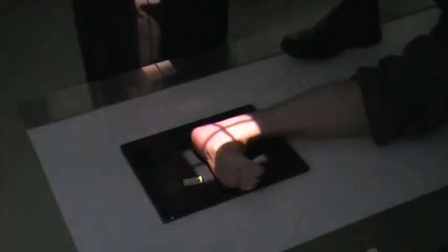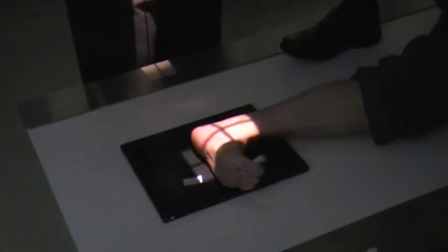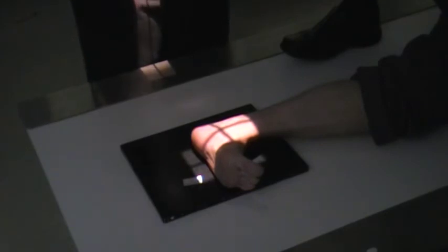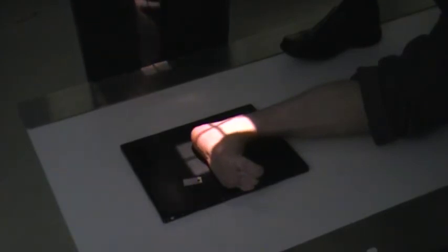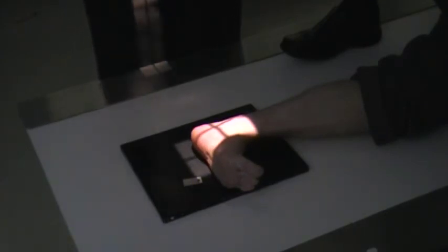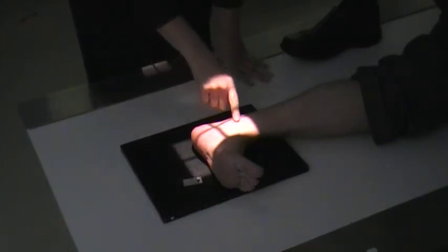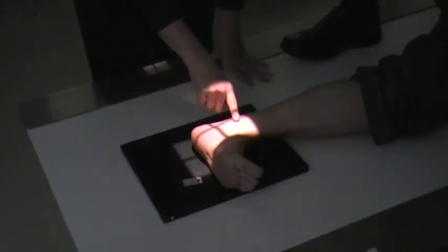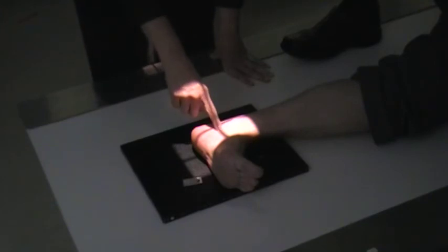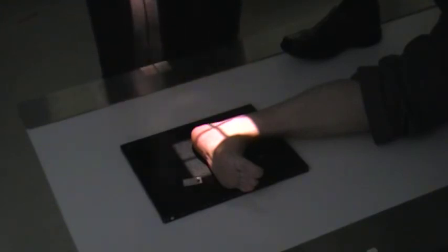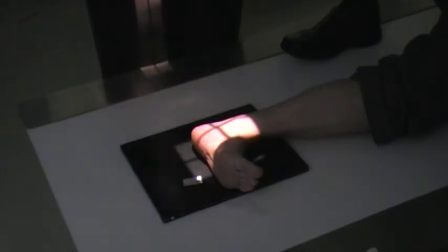Next, I'm going to do the lateral for the calcaneus. You have your foot on the lateral surface. From the medial malleolus, you're going to have your central ray come down approximately one inch.